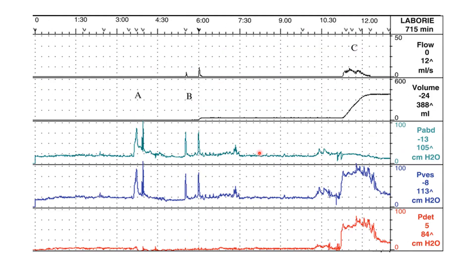This slide again shows a normal urodynamic graph. The flow line, volume line, filling phase, and micturition phase are visible. The abdominal pressure and vesical pressure lines are shown. Whenever abdominal pressure rises, vesical pressure rises simultaneously as well. During the filling phase, there is a slight rise in vesical pressure, which is normal. However, this should not result in leaking.